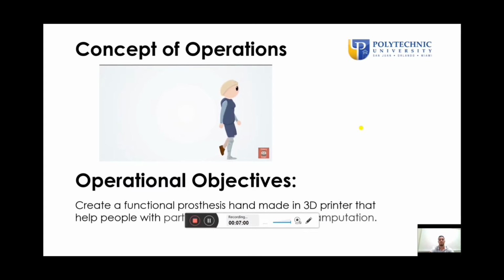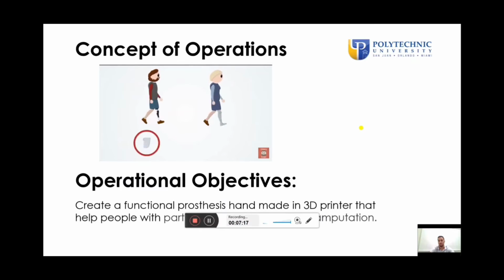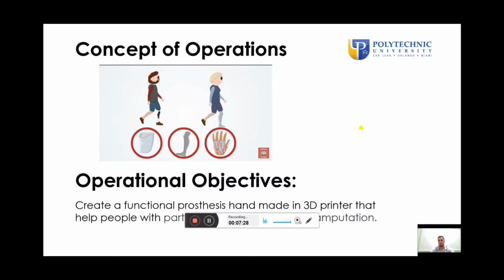These were invented in the 16th century, but what is shocking is that this invention is still common in modern prosthetics, even though they were invented nearly 500 years ago. Up to modern day, these prosthetics saw only small improvements. Although this is not to say that advancements were negligible. Improvements, such as a prosthetic being attached through suction, aluminium prosthetics so the wearer didn't have to drag a heavy metal leg or arm around, and the most amazing of them all, a hand which could be locked into different positions to allow the user to hold objects in their prosthetic hand, such as a fork for eating.